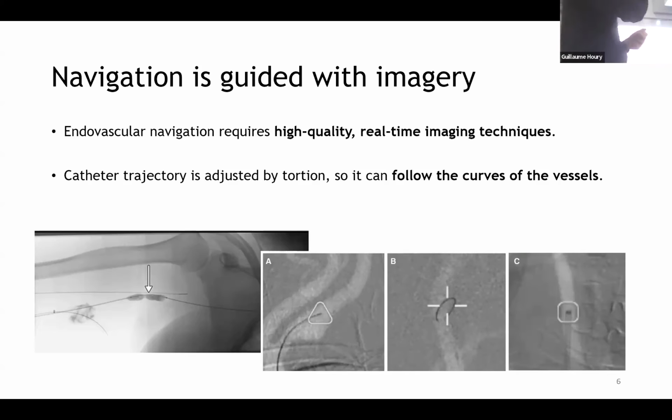Yes, because something that is not obvious on the pictures that you made is that the catheter does not end with a straight head, but there's an angle. So basically, if you apply torque on the wire, then the angled part of the catheter is going to rotate, and then it allows you to choose the precise path.